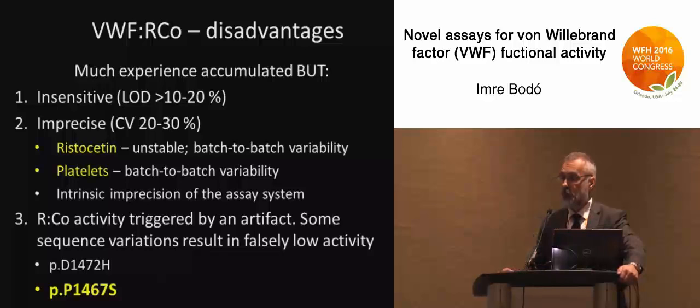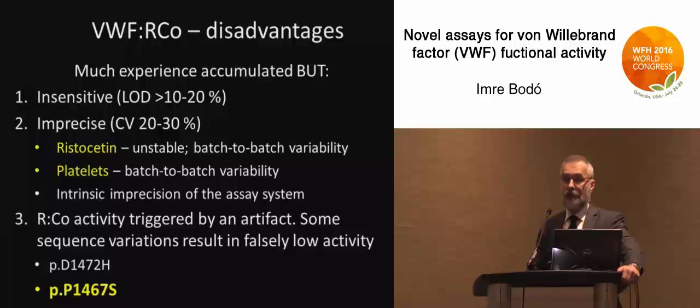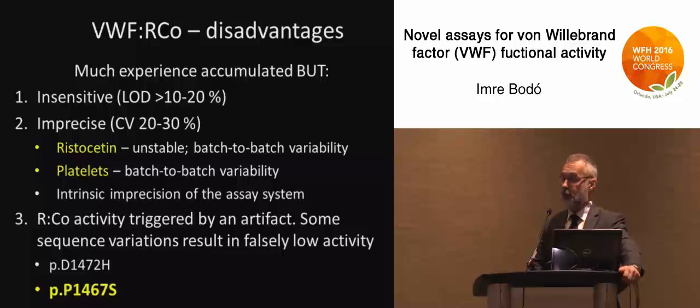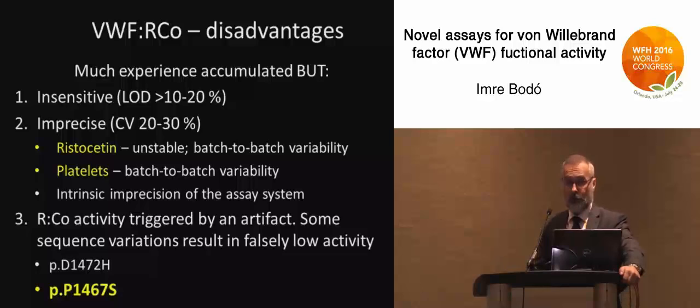The ristocetin cofactor assay suffers from a number of disadvantages. It's very insensitive — the limit of detection is sometimes as high as 20% and never goes below 10%. That means in patients who have low levels, where we need this information the most, it is not available. It is also very imprecise; the coefficient of variation goes up to 30%, meaning that if we repeated the test enough times in anybody, we could find low levels suggesting von Willebrand disease, which is obviously false.